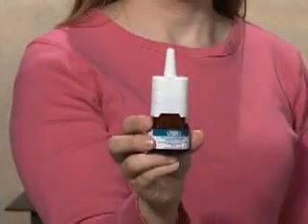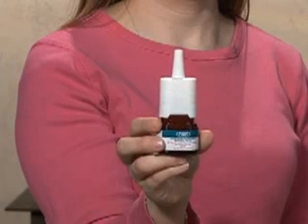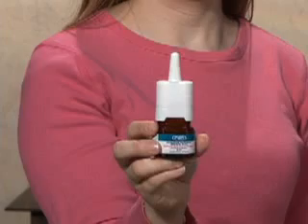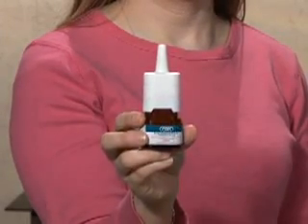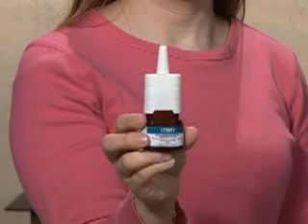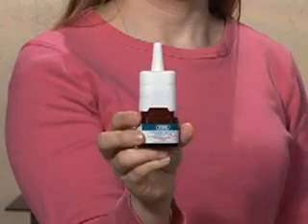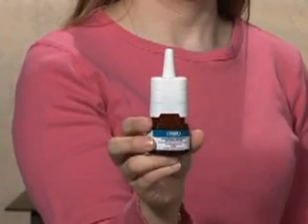If the directions on your prescription state that you are to use a second spray in the other nostril, simply repeat the process with the other nostril. If you are to use two sprays within the same nostril, wait at least one minute and repeat the process reviewed earlier. By waiting one minute between doses, the second dose will provide more beneficial effects.